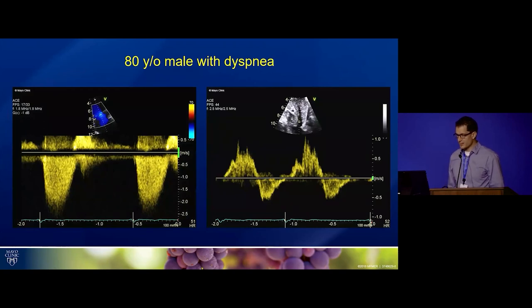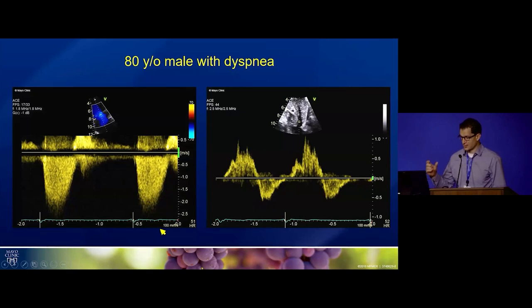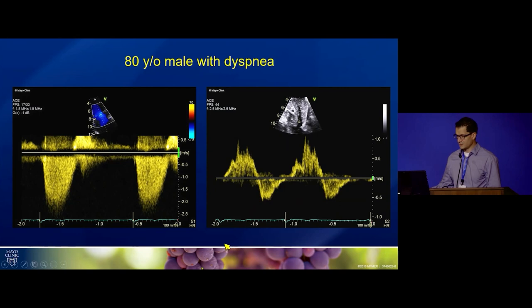Spectral Doppler is our window into hemodynamics. We see a peak TR velocity of about 2.2, and this may not necessarily be reflective of pulmonary pressures because of the amount of tricuspid regurgitation — we can underestimate the right ventricular systolic pressure. There are also very prominent systolic reversals in the hepatic veins.